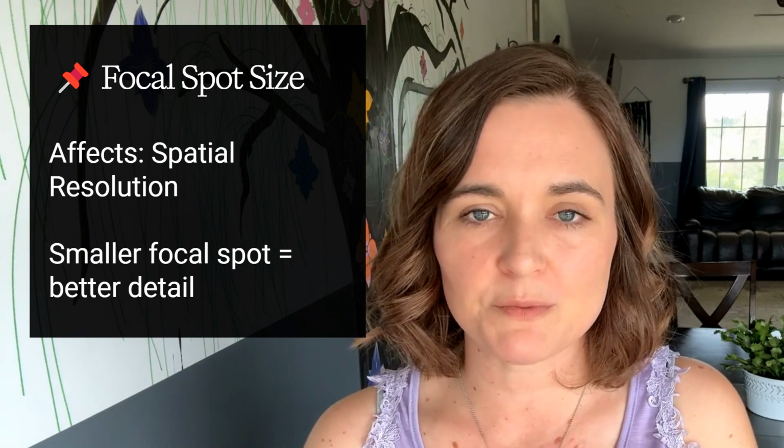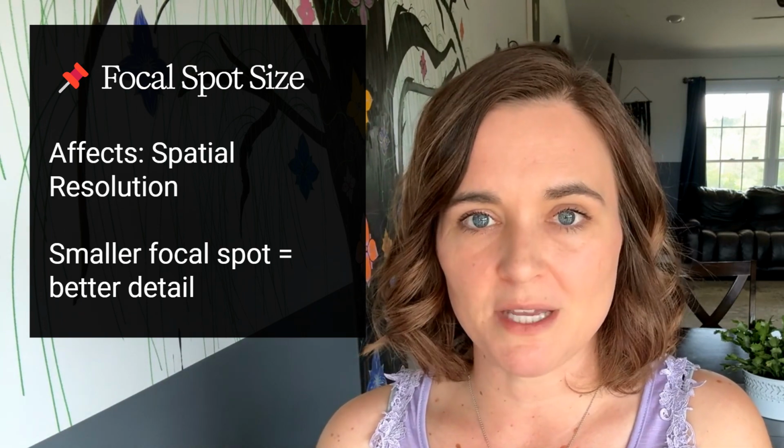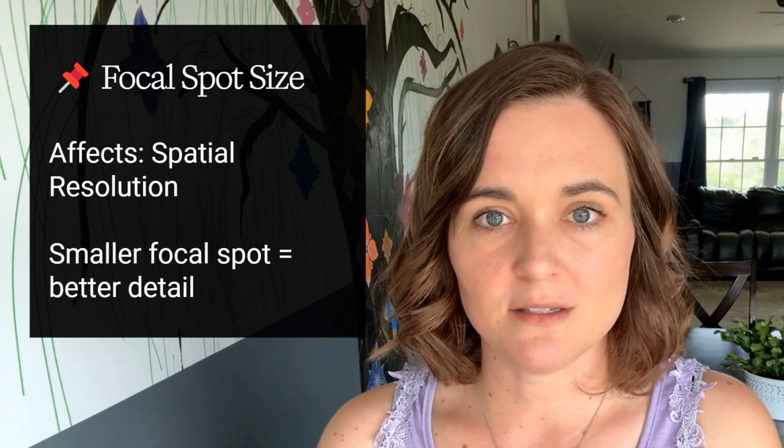The smaller the focal spot, the better the detail. Larger, you have more unsharpness. Clinically, this is used when detail is critical, like in extremities.